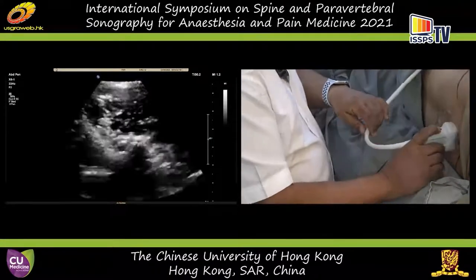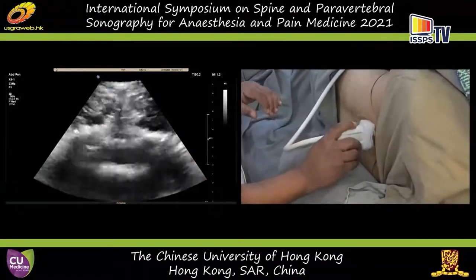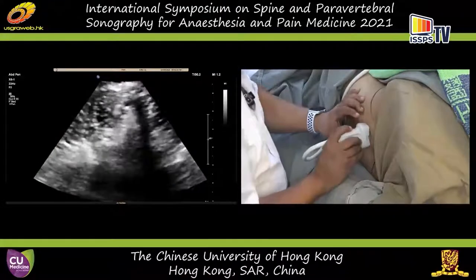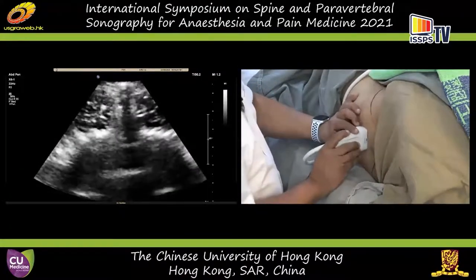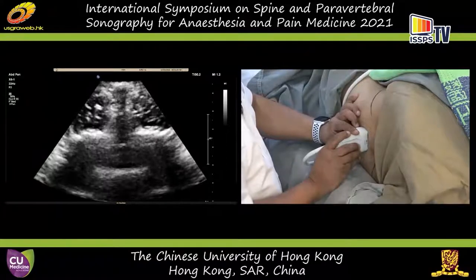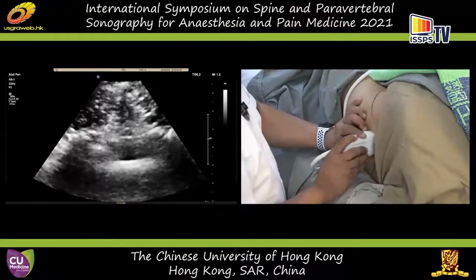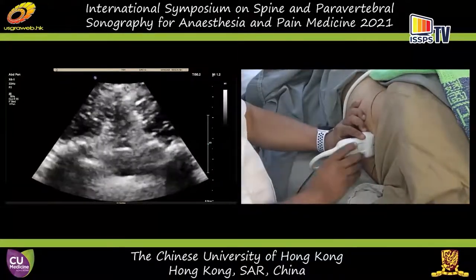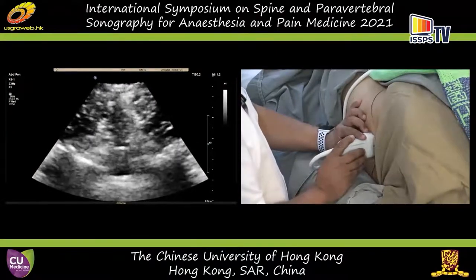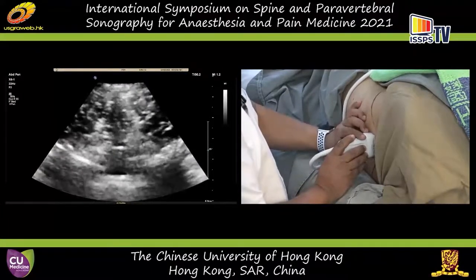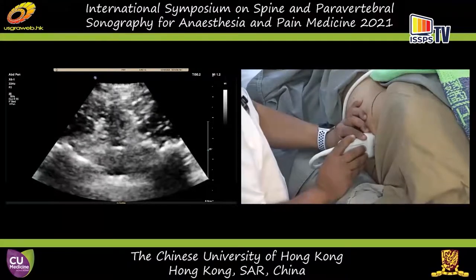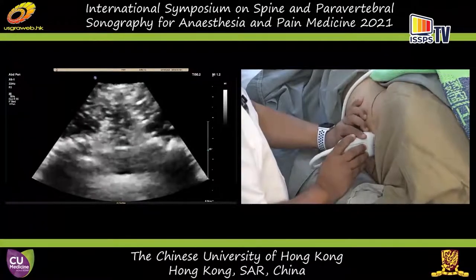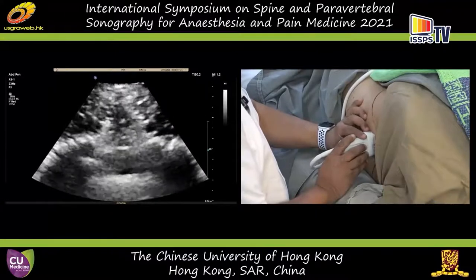We are not going to use it for 3D without the coronal view, but we can show you how the biplanar view will be. This is a 2D view of the lumbar spine of the same space — L4-L5 — that we saw before. A very important principle with multiplanar imaging is that you have to make sure your 2D images are good, because if your 2D images are not good, your volume will be poor and anything you render thereafter will be poor. We are doing real-time biplanar imaging.